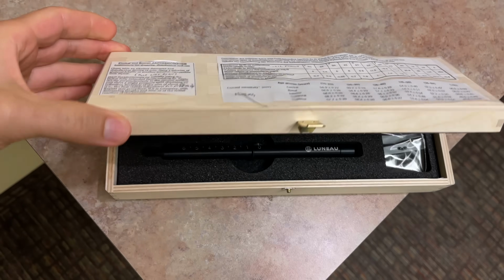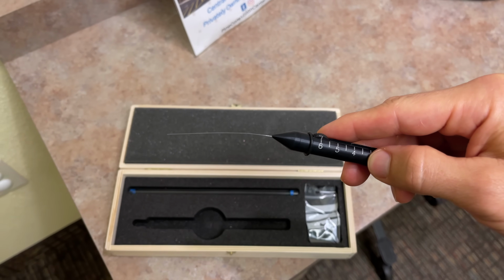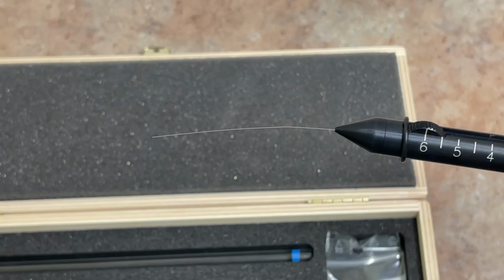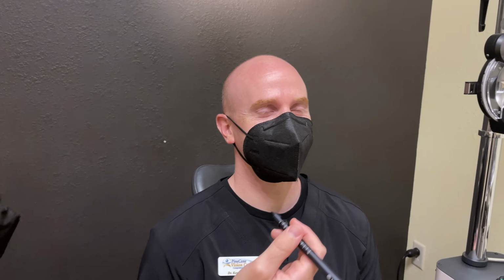But the one other test that we do is that of corneal sensitivity testing, specifically using what is called a Cochet-Bonnet test. The Cochet-Bonnet kind of looks like a pen, but when you extend it, it looks like fishing line kind of comes out to a certain length. And when this line is fully extended, the tensile strength is very low, but your doctor will literally come toward you and just barely touch the front surface of your eye. And you'd be surprised how many people cannot feel that. If somebody's corneal sensitivity is normal, they should feel that even at just a little bit coming close to them.